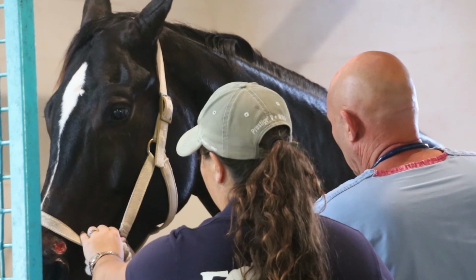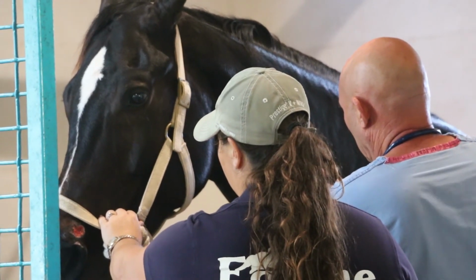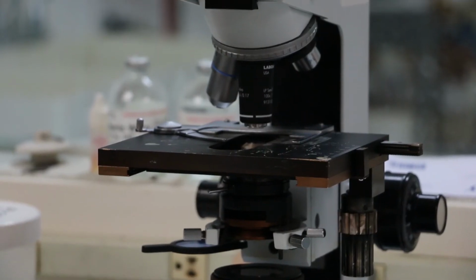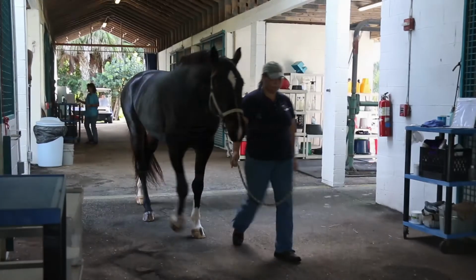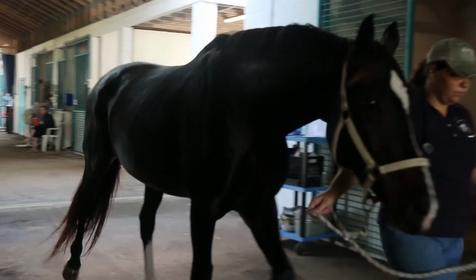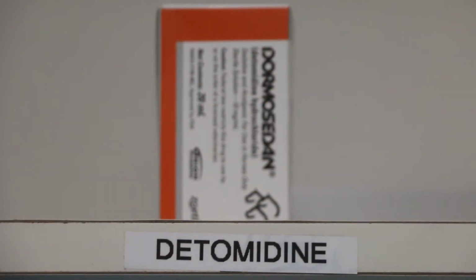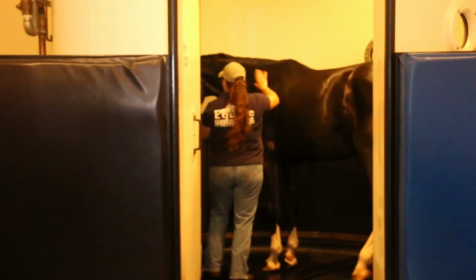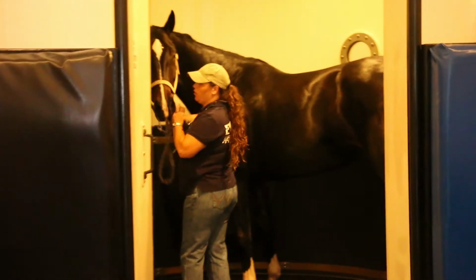There's no real downside. We use detomidine for a number of reasons, but mostly because it is the safe tranquilizer sedative to use. The alpha 2s. We avoid narcotics and respiratory depressants and some of the other tranquilizers. Detomidine is a drug of choice. Xylazine is probably allowed, and so is romifidine, but detomidine is what we almost always use, intravenously and intramuscularly, and it works extremely well in the chamber.